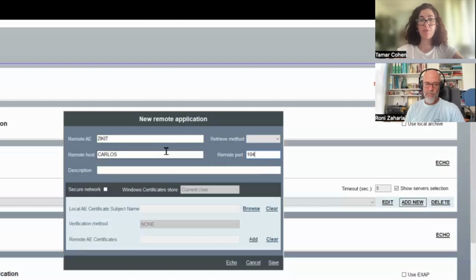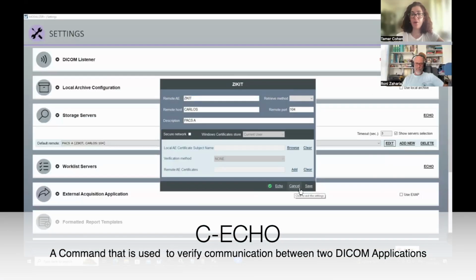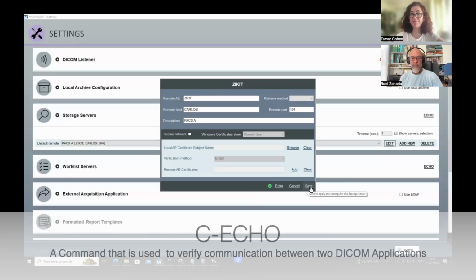Okay, so now that I've put in the remote AE title, remote host, and remote port, and I'm making sure these are all correct, what should I do next? Let's verify it. We have a DICOM verification service, the C-echo command. Just click it. Okay, so now that it's verified, I can save, right? Yes.